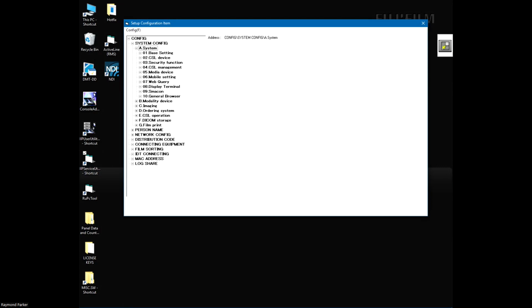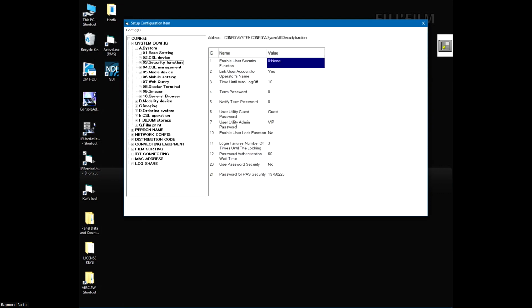So in this instance, as I come into groups and then go to systems, I'll click on security function, and immediately we can see enable security. I can either select that with the down arrow. I have a choice of ID and password, which most sites will be. I did want to take the opportunity today to actually show the workflow for including smart cards. So what I'll do is set up one that will include the smart card or ID password.